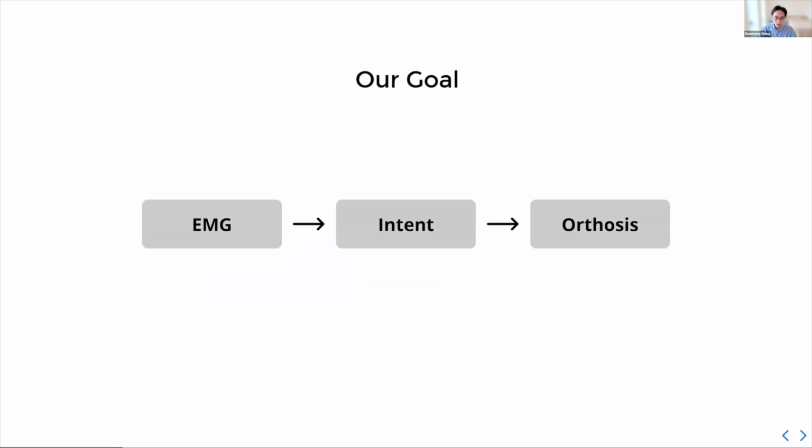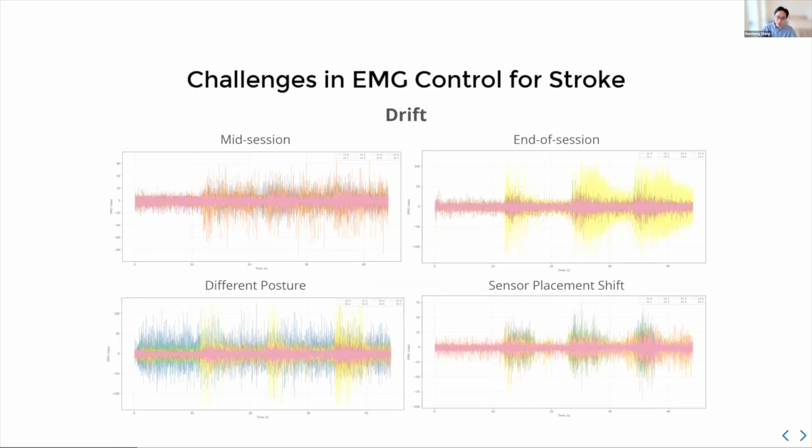So once again, what do we want? We're trying to turn EMG into an intent, the intended gesture, and use it to control the device. And as it turns out, this is a difficult problem in 2 ways. The first being that everybody is different. Even in a healthy population, the signals can vary drastically.